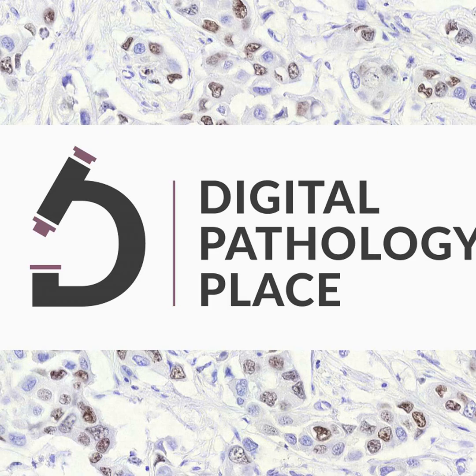And while there are concerns about AI taking over jobs, the reality is that it's mainly used to assist humans in completing tasks. For example, AI can assist in counting brown cells stained with IHC, highlighting the neoplastic cells in tissue samples, or performing other repetitive tasks on pathology images, but is not yet advanced enough to replace human expertise in more complex diagnostic processes. And when AI predicts something from the image that's not visible with the human eye, which is the case when predicting molecular properties of tissue, it currently merely replaces a different test, a genetic test.